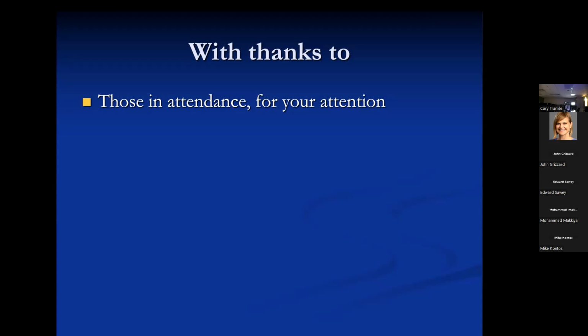Dr. Grizzard, thanks again for this wonderful talk. I wondered, when you were doing the review of 900 plus cases with Chet and Shenoy, did you all see what was clinically read on those cases? Or I guess what I'm asking is, what are the most common pitfalls that you've seen, masses that are mischaracterized by clinical readers, not the expert reviewers like you and Chet? Any advice on how to avoid those misclassifications?